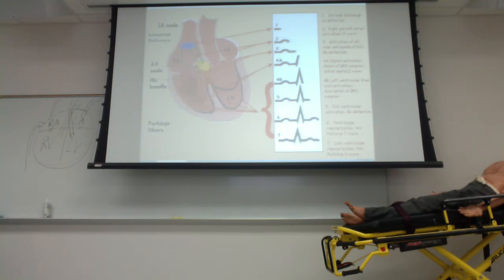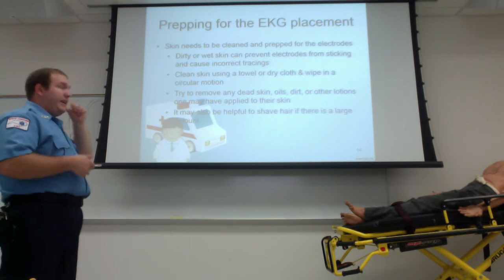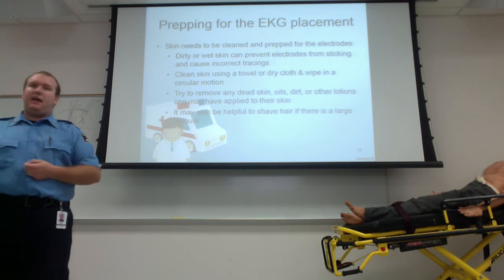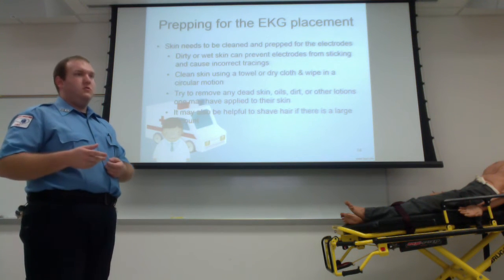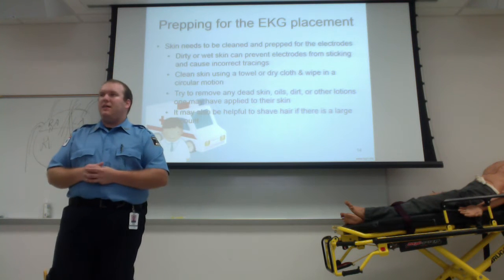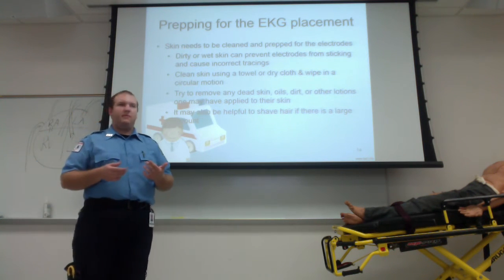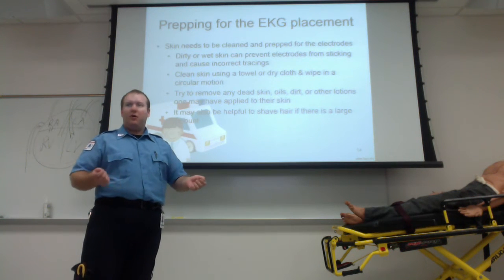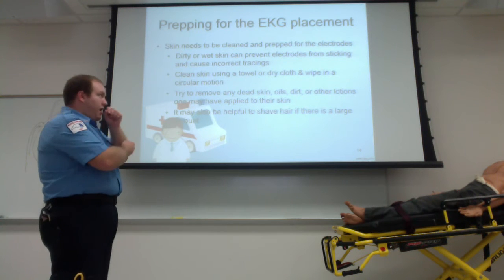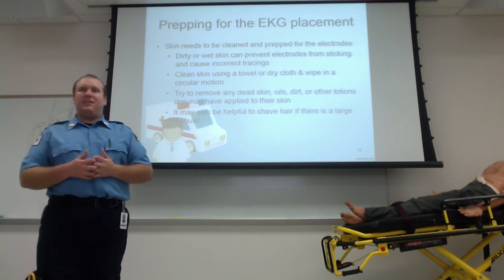All right. Next one we're talking about is prepping for our EKG patient, or EKG placement, I'm sorry. And like I mentioned earlier, you see so many paramedics who come up, and it's not just paramedics either. Even the respiratory therapist or whoever does them in the hospital will do the same thing. A lot of them just pull up their cart, slap stickers on, hit print, they're done. However, believe it or not, that's not exactly the best way to do it.